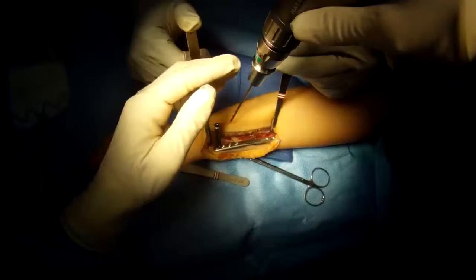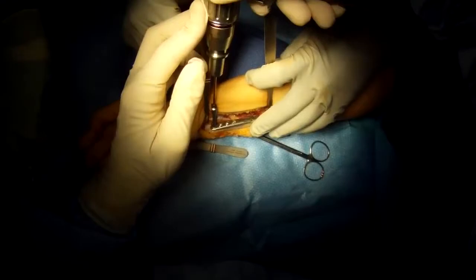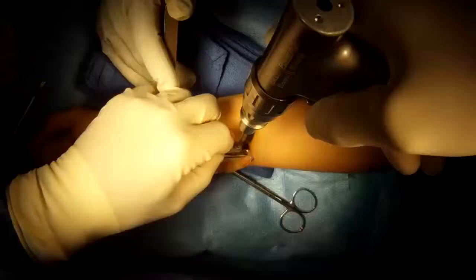We're placing a specially designed plate on the ulnar bone, screwing it into position. The screws hold the plate to the bone.